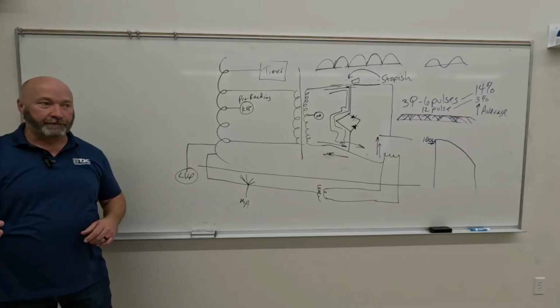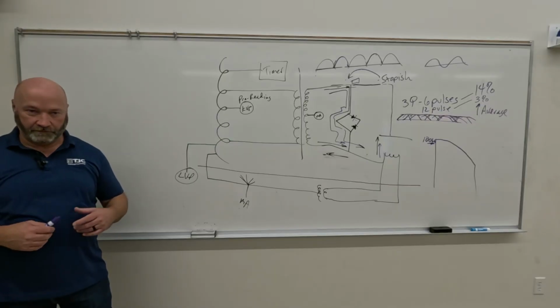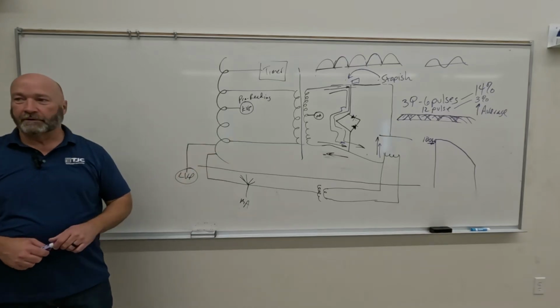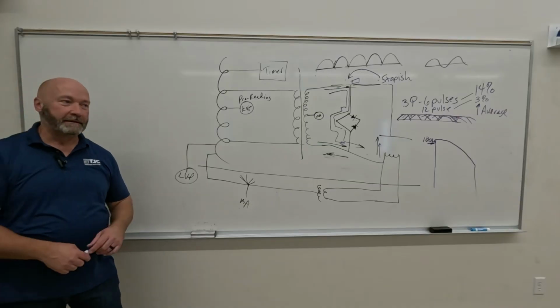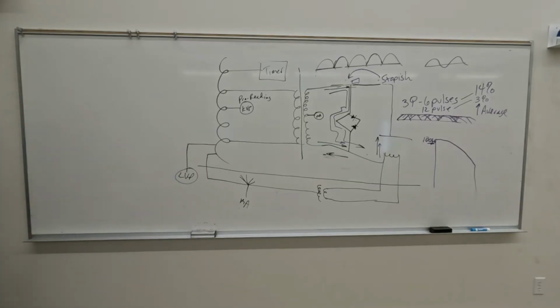So the purpose for a falling load generator is the shortest possible exposure time. Purpose for capacitor discharge is just to confuse you. Again, something else I think probably should come off the registry. Probably shouldn't be in the textbooks anymore. Okay. So voltage ripple was on the next page.